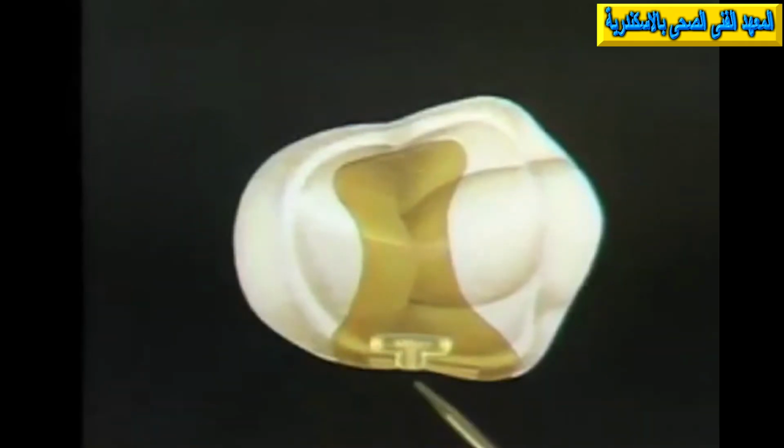The essential form of the keyway has now been established, and it remains only to round off the sharp axial line angles, finish developing the flare, and open the entrant angles and smooth these off. The final finishing of the keyway is achieved with a 600L finishing burr, in which all the surfaces are smoothed off. It's checked for adequate taper, smooth entrant angles, and smooth axial line angles. It is then ready for the next stage of waxing the key itself.